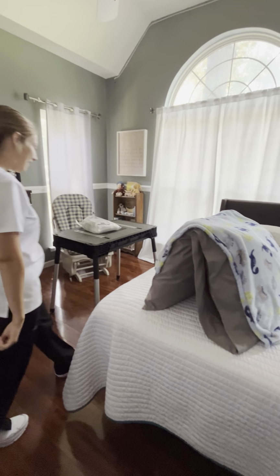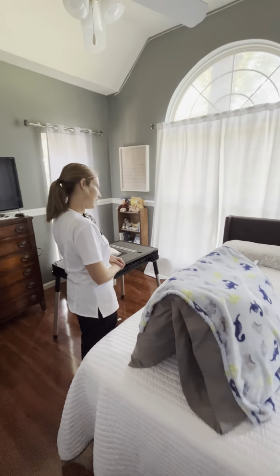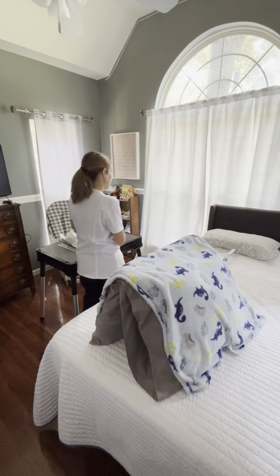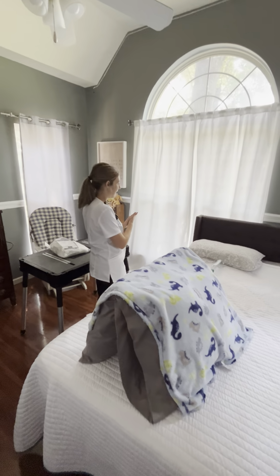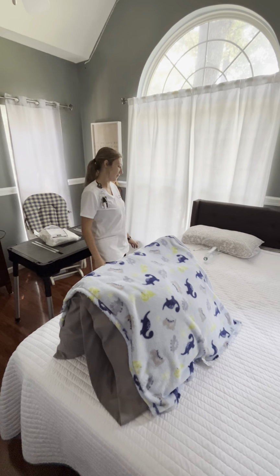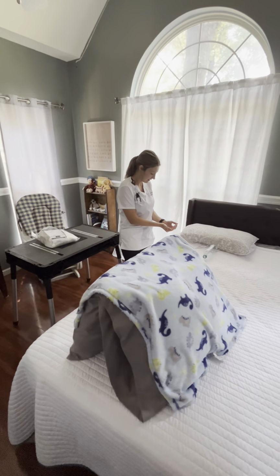Knock, knock, knock. Hi, my name's Lisa. I'm going to be your student nurse today. I'm going to go ahead and provide privacy, do some hand hygiene. Can you tell me your name and date of birth? Great, thank you so much. And can I see your wristband?